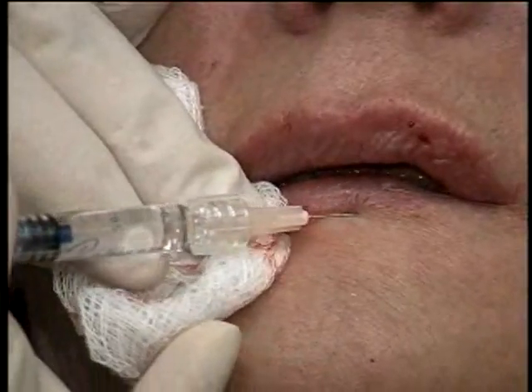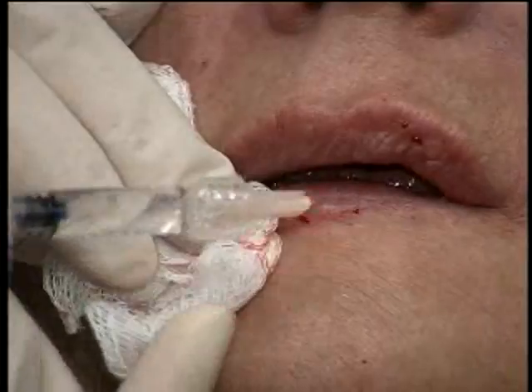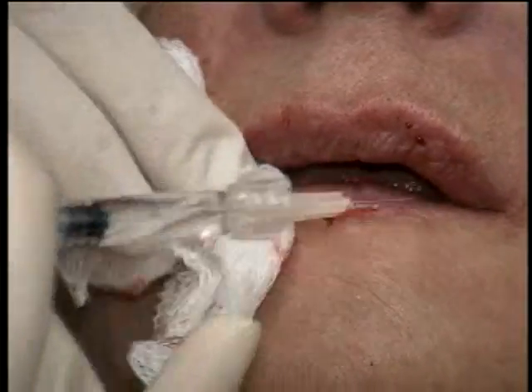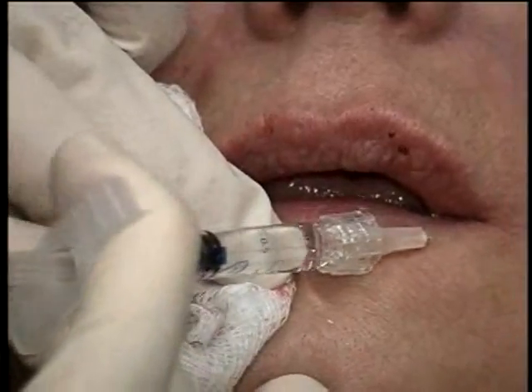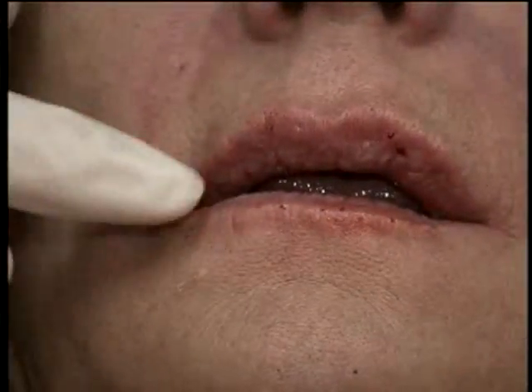All the way across the lower lip until I get to the other side. Okay. I think that looks pretty good.